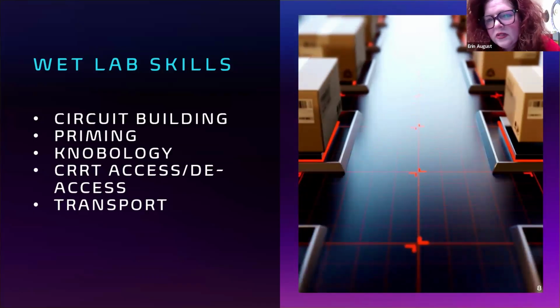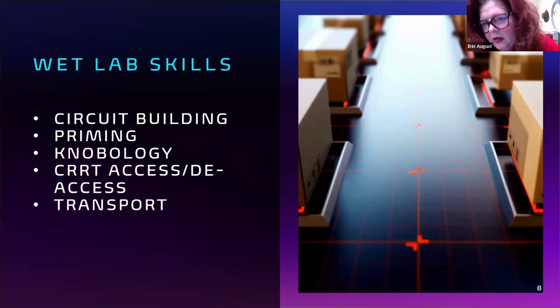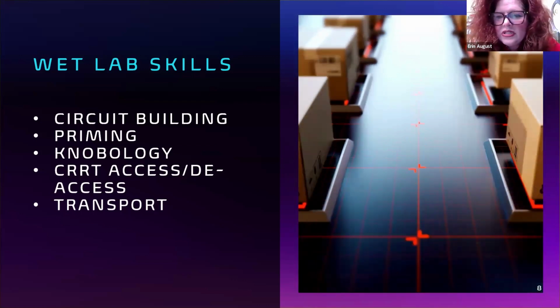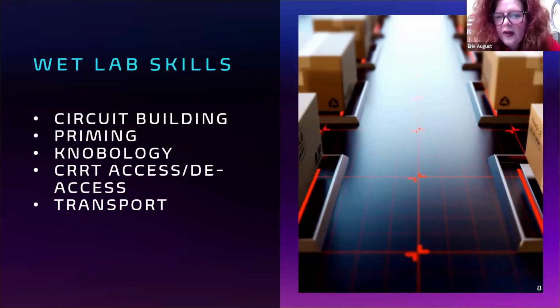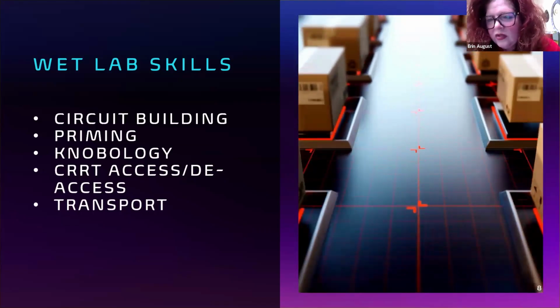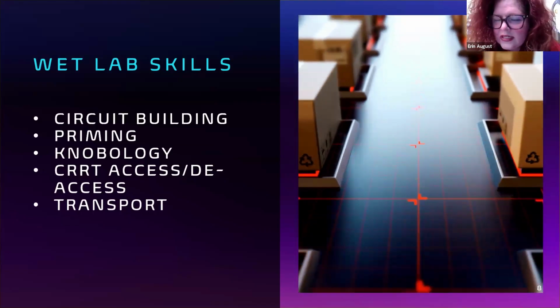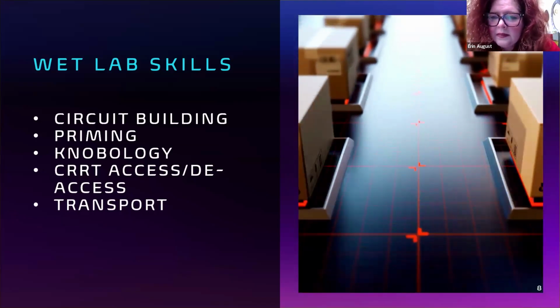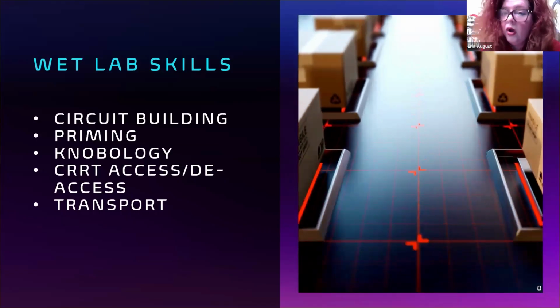So important things to know and practice, because although it may seem like, oh, we're just taking them here, we're just taking them there. Remember, you have the sickest patient in the hospital, and you have these large French-sized cannulas coming out of your patient, and you've got tubing, and you've got pigtails, and you've got stopcocks that could get turned. There's multiple things that can happen that sometimes we overlook. So it's better to be over prepared.